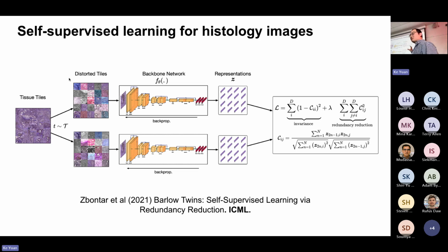So this is a relatively old self-supervised learning approach, which is called Barlow Twins. It is not really the state of the art anymore. If you look at pathology foundation models nowadays, it's basically all different approaches. But this particular type of approach we like very well because it has very interesting properties. What you see is that this self-supervised learning approach relies on quite a lot of very heavy augmentation of the color exposure of the images.